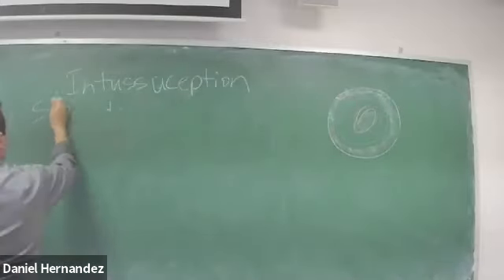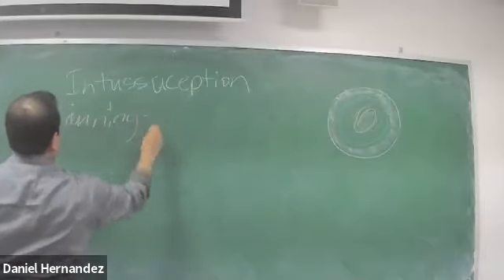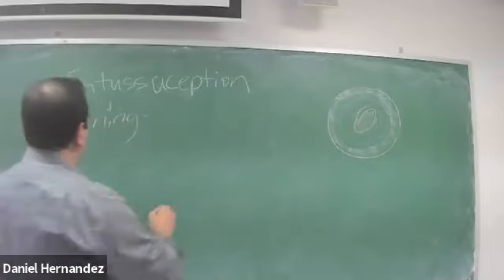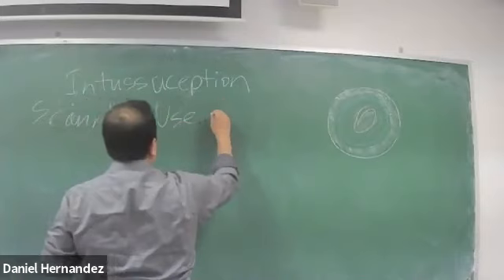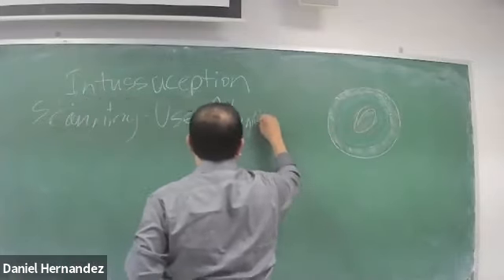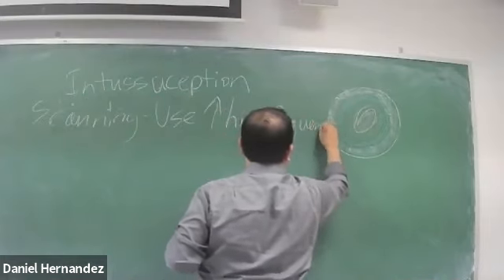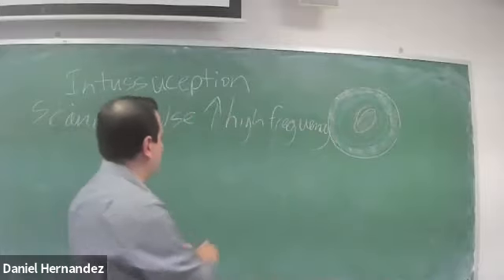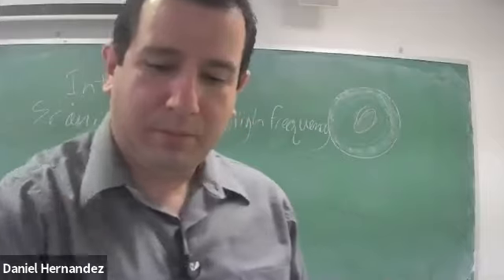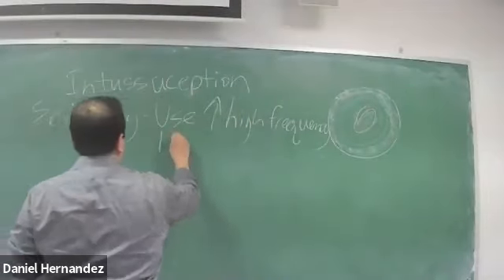Scanning. So our scanning technique for intussusception, we're going to use, again, a high frequency linear probe.